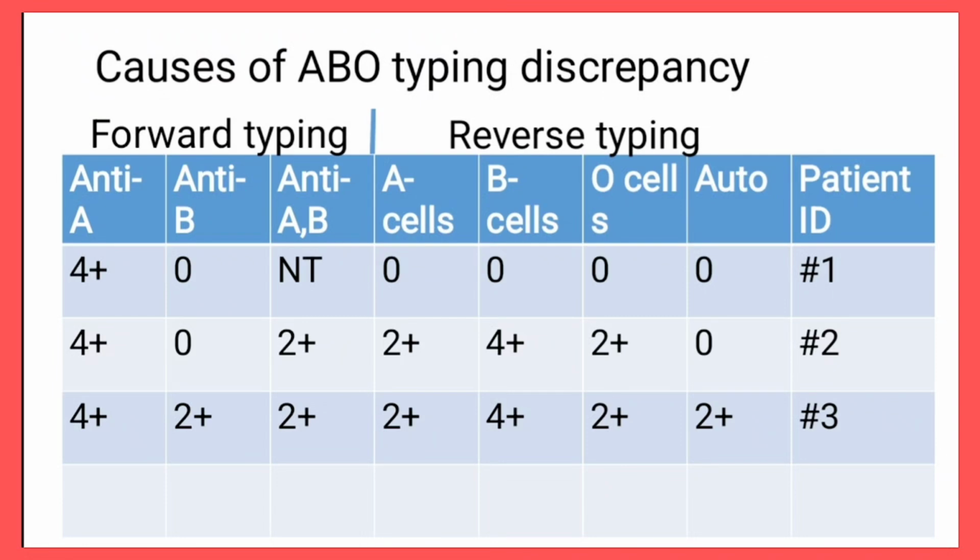Okay, now let us look at what could be the possibility of this kind of result that we've gotten.